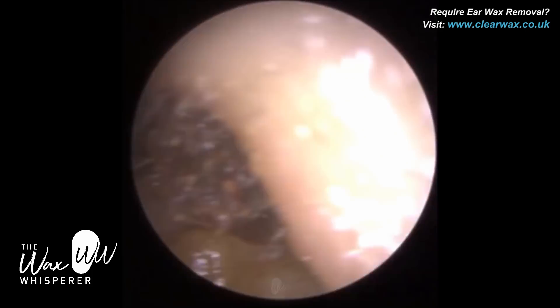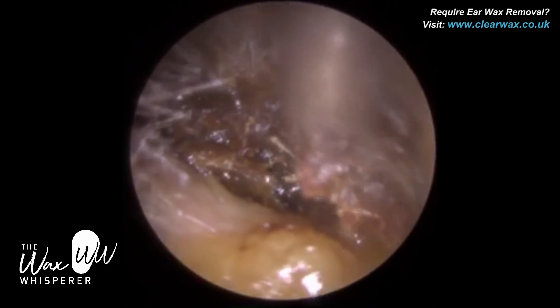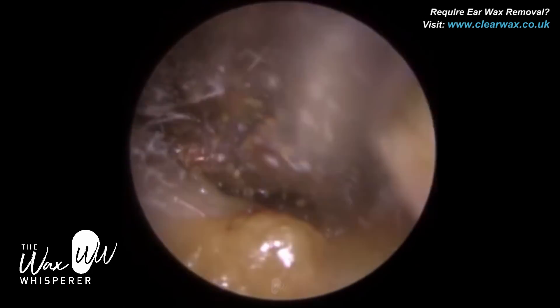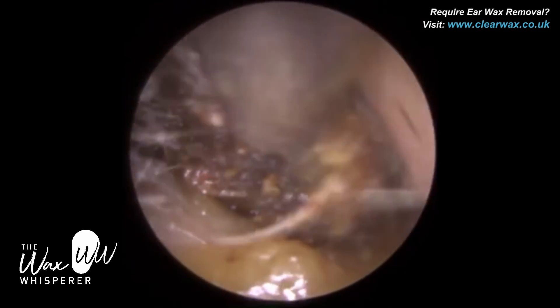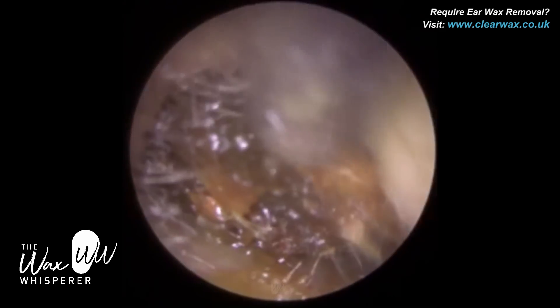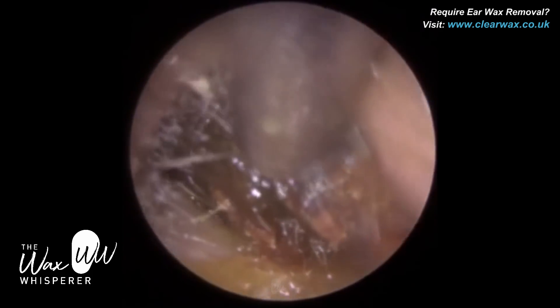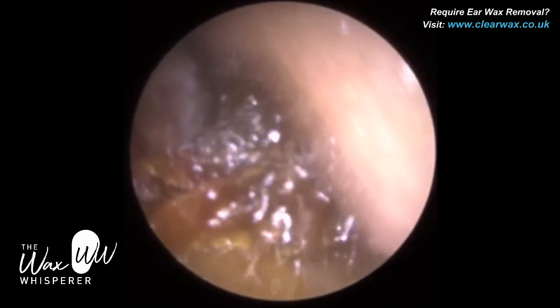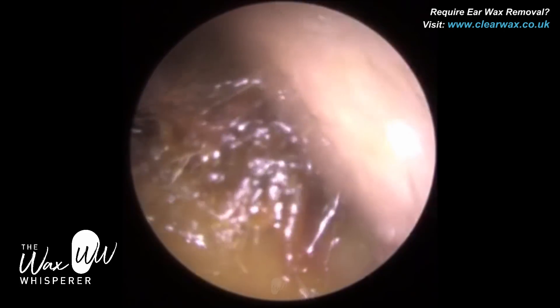I'm just extracting now. You can see a bit of keratin came off the wax there. The client's entrance to the ear canal is a bit narrower than the main aperture, so the wax gets trapped — that's why I'm wriggling it through. The oil also helps by providing lubrication, similar to putting soapy water on a stuck ring on your finger. Olive oil not only helps bind the wax together to get a better suction grip and make the wax come out in big plugs, it also lubricates the ear canal wall so the wax wriggles out more easily. I'm making very tiny circular motions, just teasing the wax through.